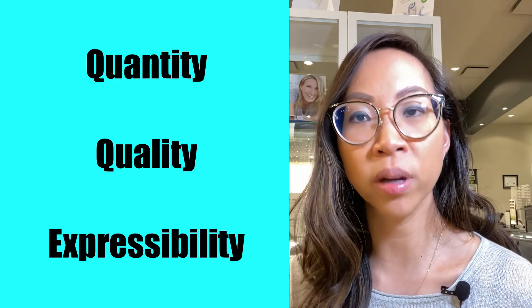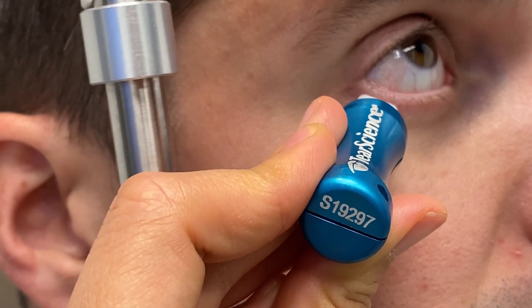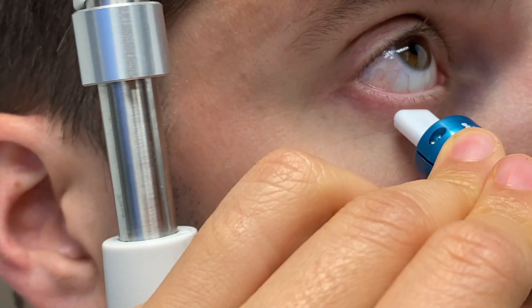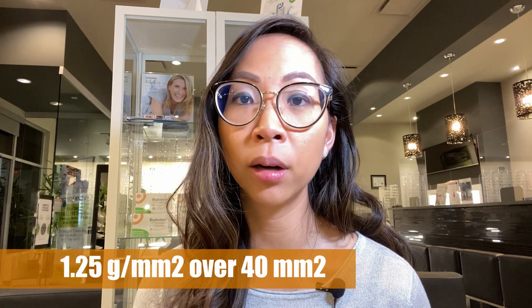So how do we assess the functionality of the meibomian glands? In general, we're grading the meibum or oil quantity, quality, and expressibility, and we use the CORB meibomian gland evaluator. It's a small device that looks like a USB stick. It is the only instrument that provides a standardized, repeatable evaluation of the meibomian gland. To evaluate the expressibility of meibum as an indicator of meibum secretion, I apply the evaluator and gently depress along the lower lid of each eye while observing through the slit lamp microscope. The pressure applied simulates the pressure of a deliberate force blink.